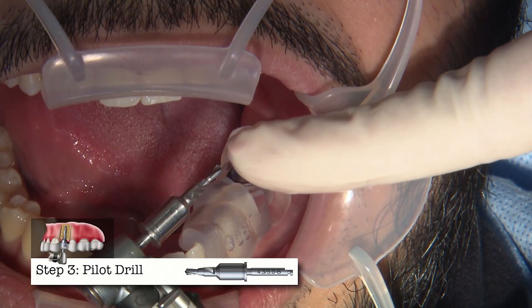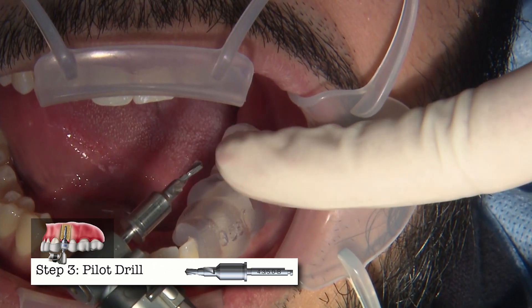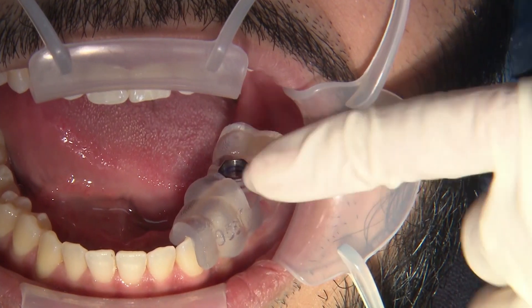These burrs — the pilot drills — come in different lengths. You want to have a purchase point to put this into, because this portion of the burr will engage the bone prior to the guided portion engaging the guide. So you do want a place to put it in.